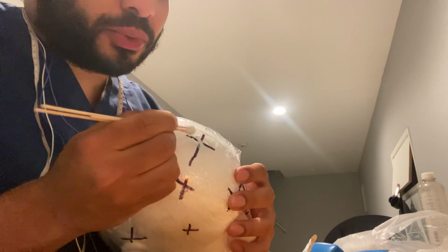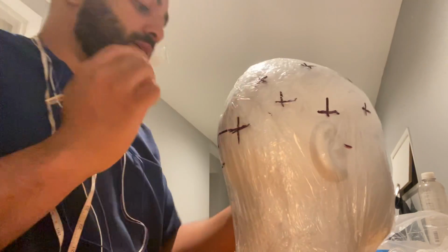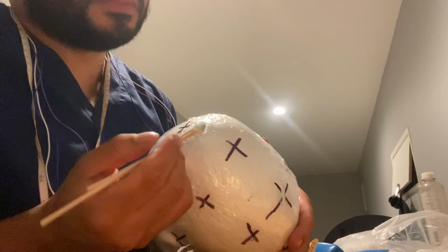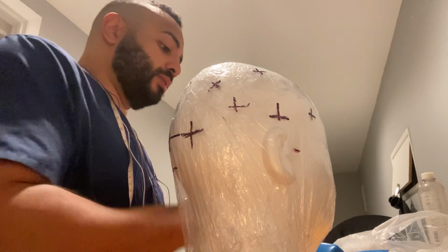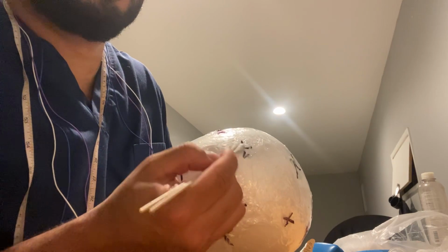For registration, we're only supposed to go one way, but for the sake of this course, we're going to rub like this. I'm going to do all three at the same time. Scrub, 2, 3. Again, more Nuprep. Scrub, 2, 3.